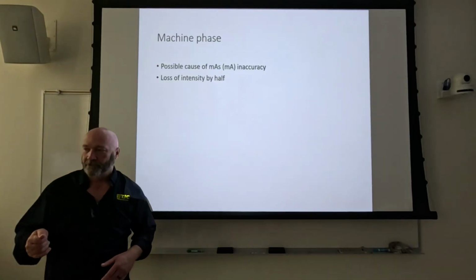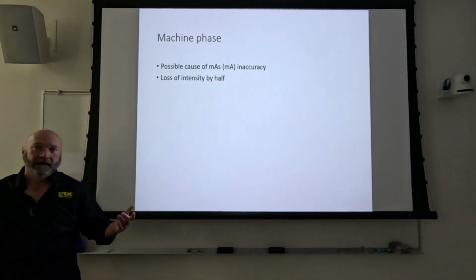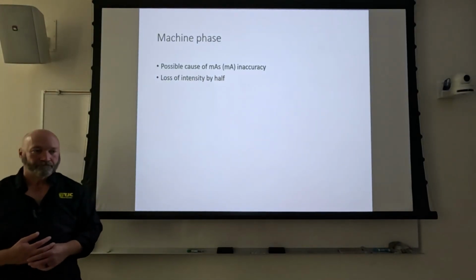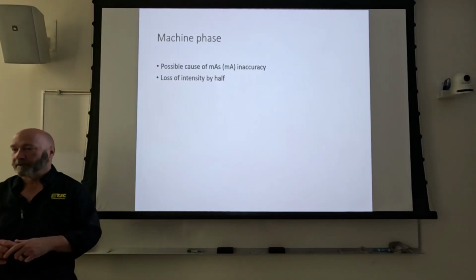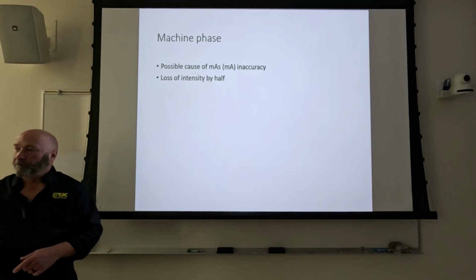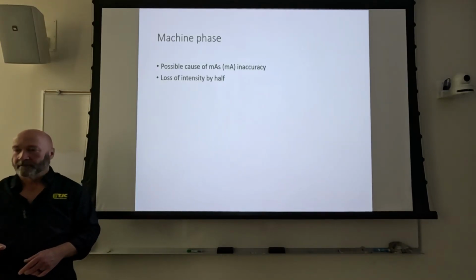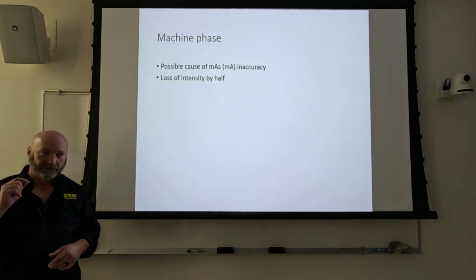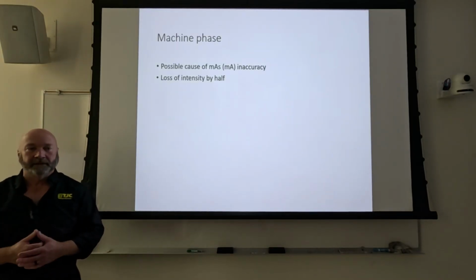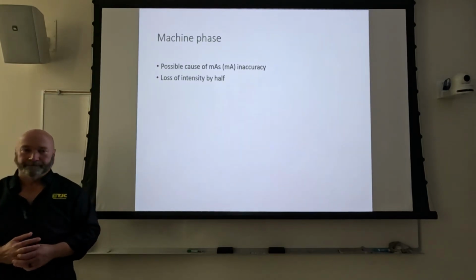You make an exposure on the patient, you set a technique. Let's say you set a technique of KUB, maybe 80 at 32 mAs. Okay, index number was perfect. First patient of the day is a follow-up on that patient. You bring them back down, you make an exposure on that patient, and your index number shows that the exposure at the image receptor was exactly half of what it should be. If it's exactly half, what could that be?